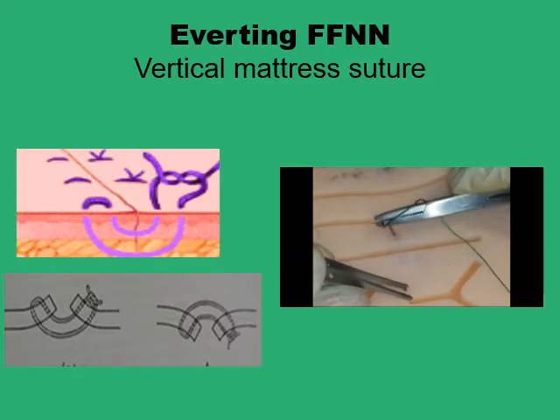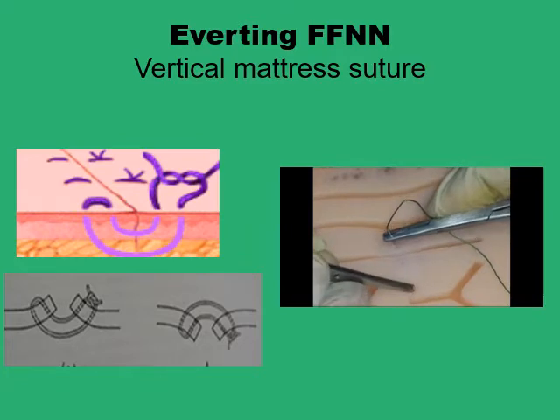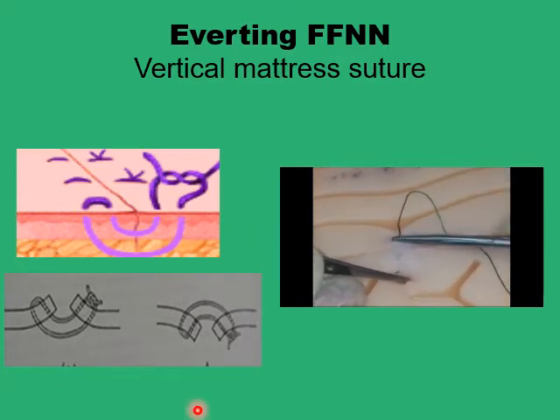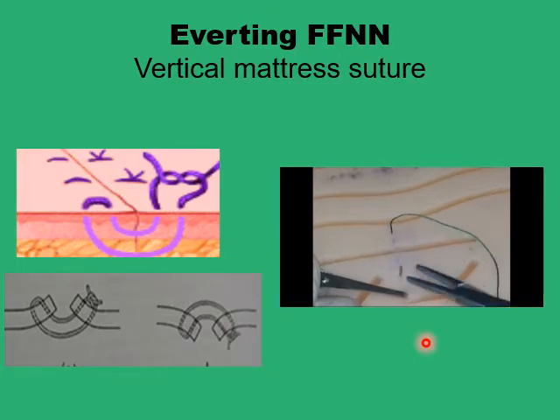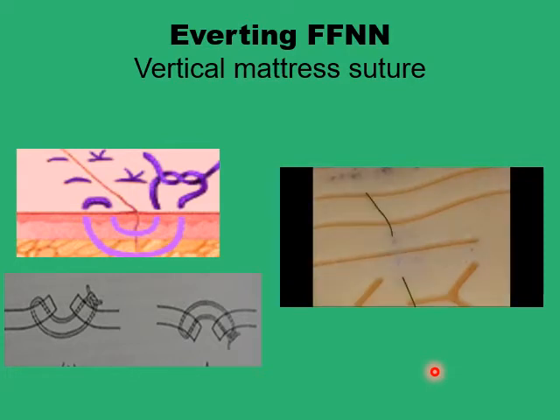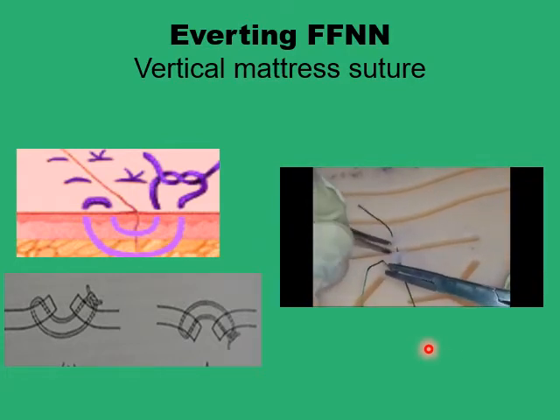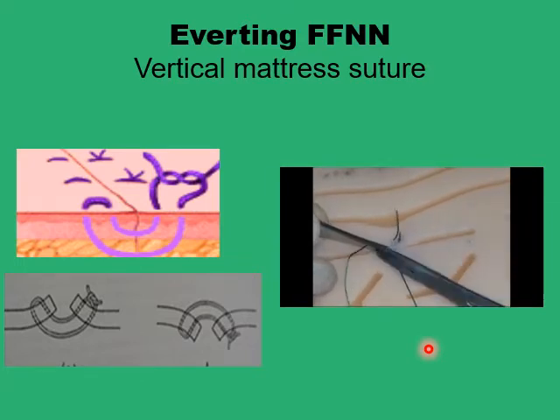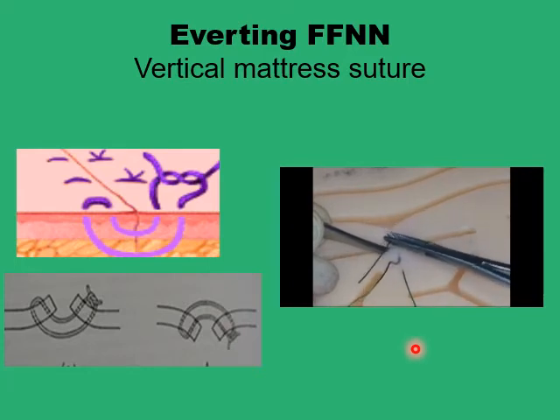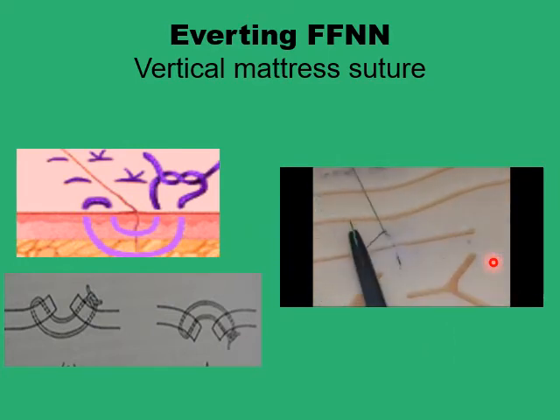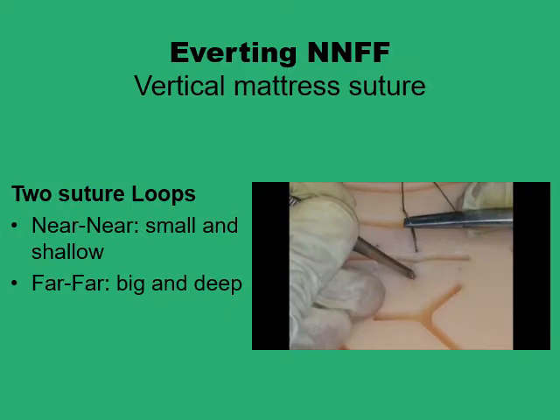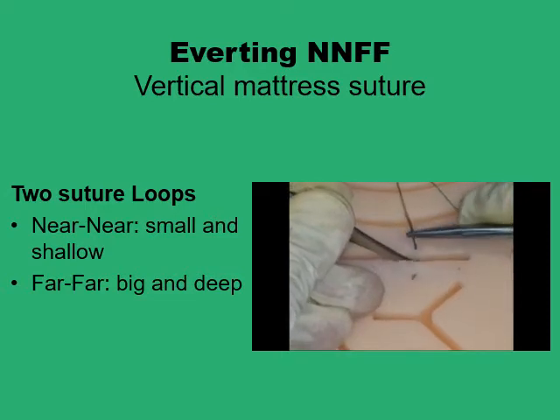I will use the far-to-far suture first — this is the first loop, the deeper and longer one. Retrieve the needle, reverse the direction, and then do the near-to-near. Now we have the two loops and you just tie the knot, and you will see a consistent eversion of the wound edge when this is tied. The same effect can be produced by using the near-to-near far-to-far configuration of the vertical mattress suture.